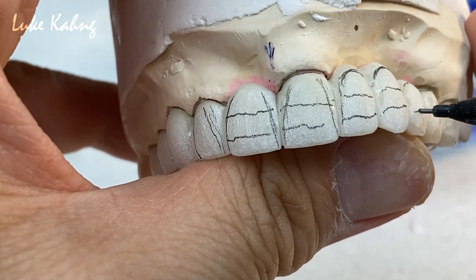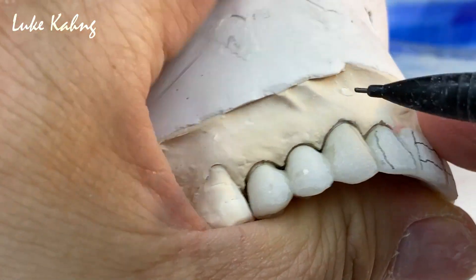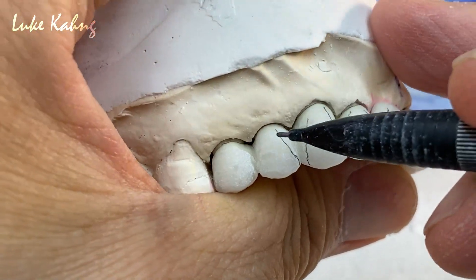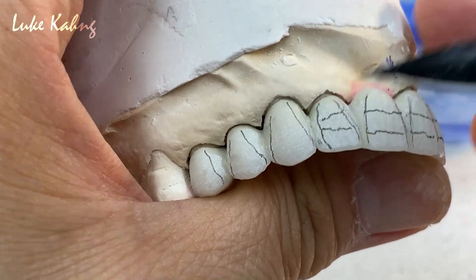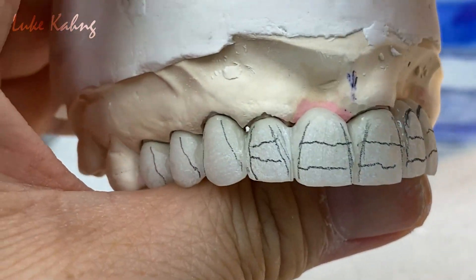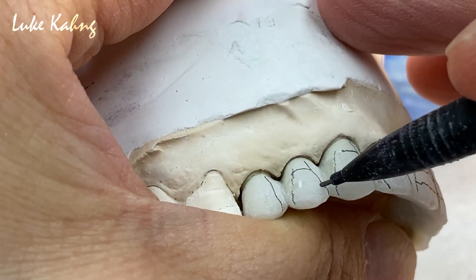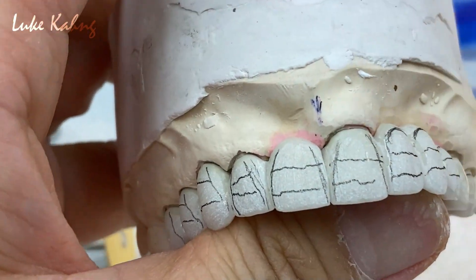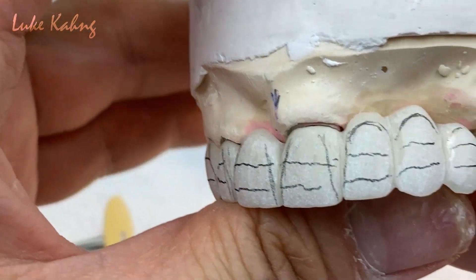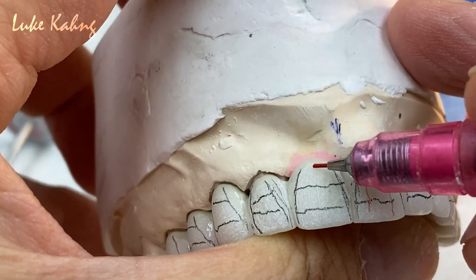Same thing — trying to match it to a canine, same kind of contour. That's a good guideline — which is a small navigator — matching as much as possible to adjacent teeth. Now in those areas we're trying to do grinding.